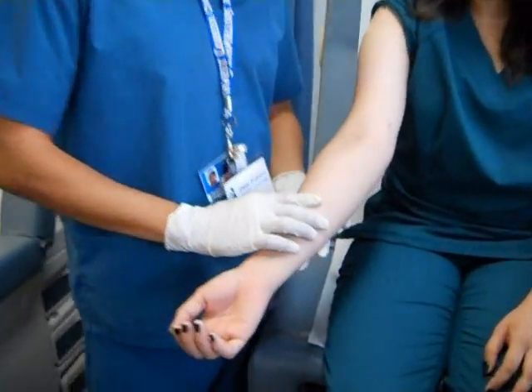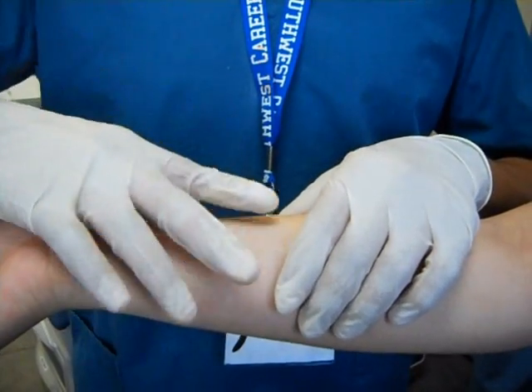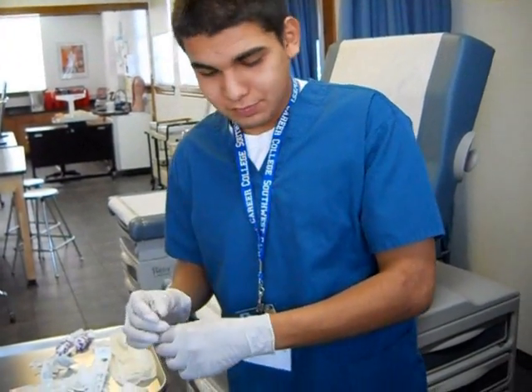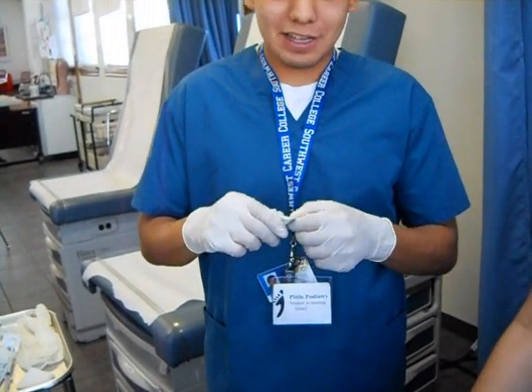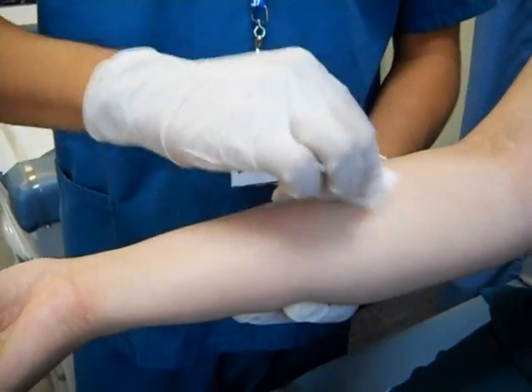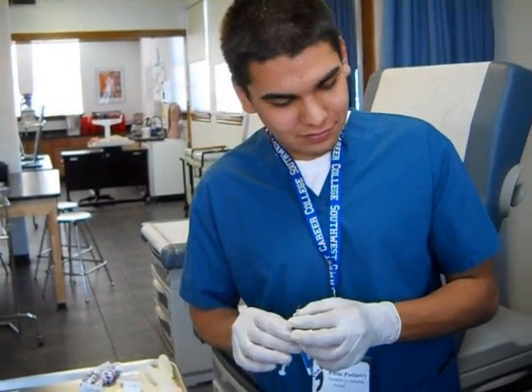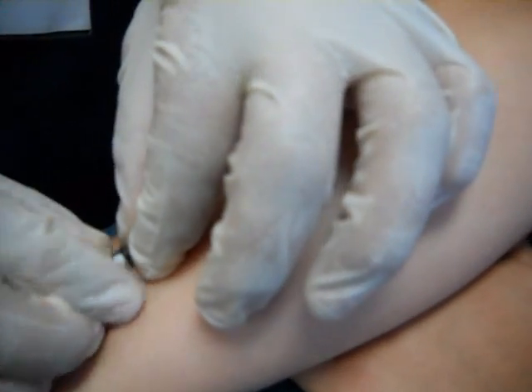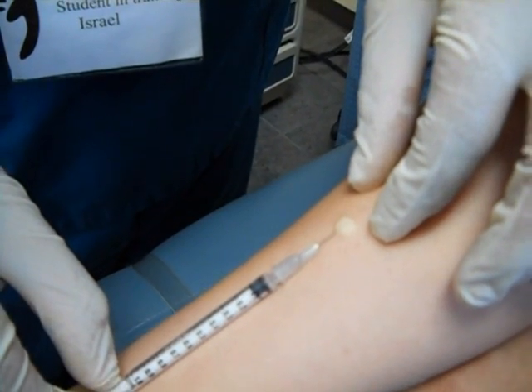Now we'll be doing the intradermal injection. It occurs right here, and you always want the needle to at least touch the skin. You're not going at a 90-degree angle but almost at a flat angle with the skin. Always use your alcohol pads — never forget to wipe down the area before you inject, or you could seriously give an infection to the patient. You want it at a flat angle to where you can almost see the needle on top. The ball that you see is normal — when you see this wheal, it means you're doing the injection correctly.